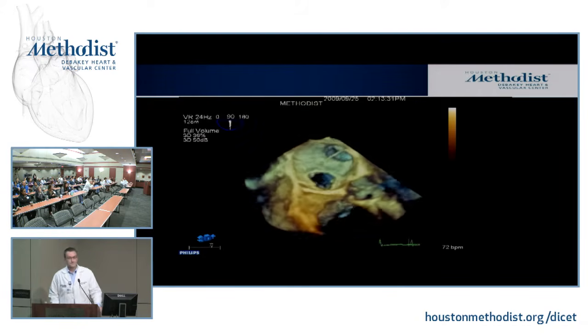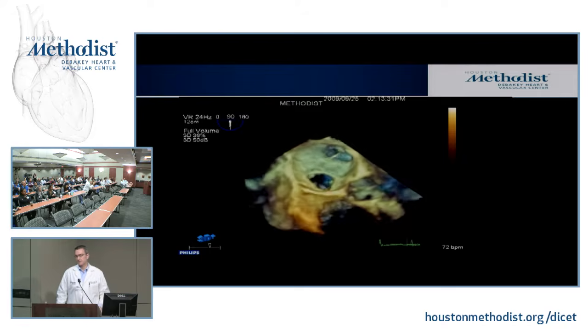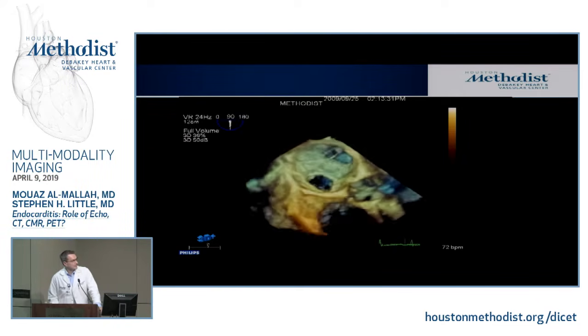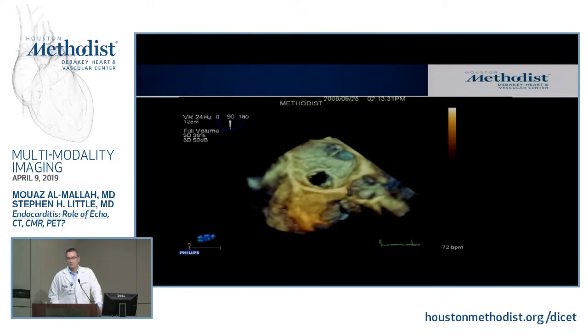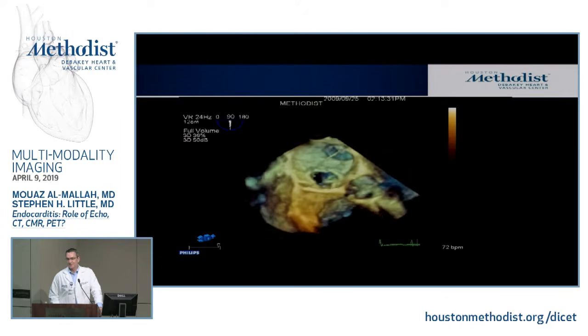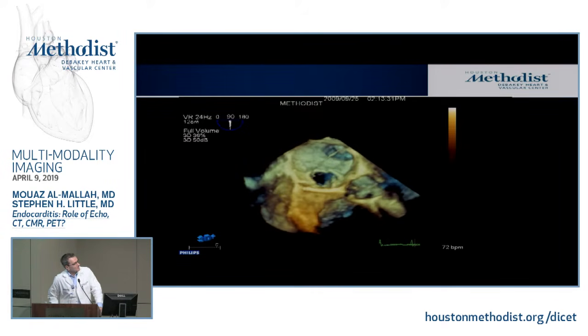Culture is negative. A short differential for something that big. I mean, that's not a malignancy. It's highly mobile and in a weird spot for a thrombus. What the hell is this? And when you don't know what to do, you often just do serial imaging. But the issue here was just open the chart.